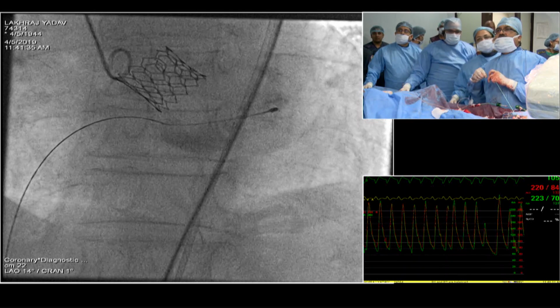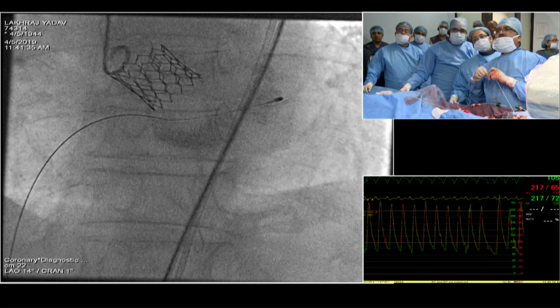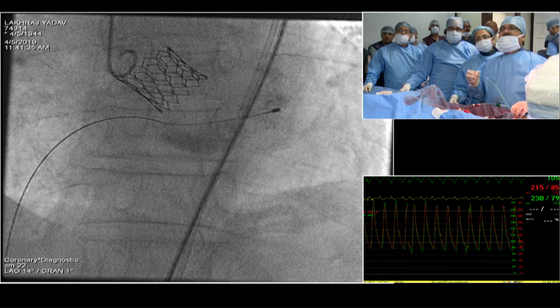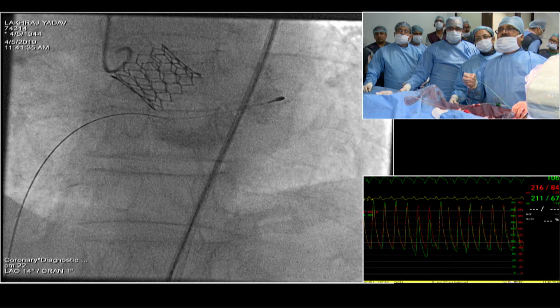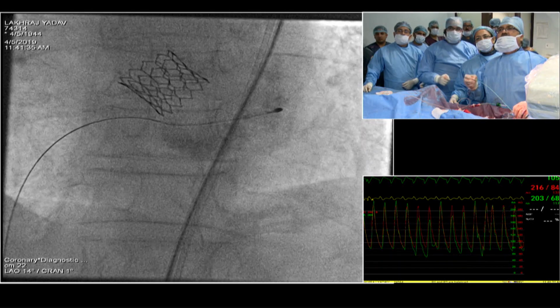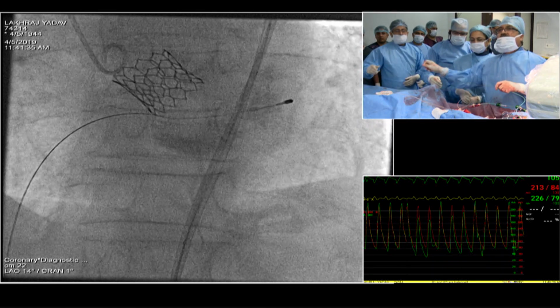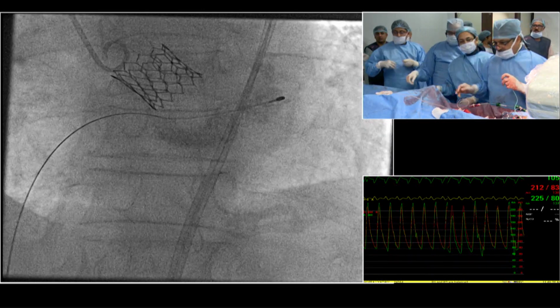Dr. Ramesh and others, actually, when the patients are so low, can you stabilize the patient a little with noradrenaline and then decide? Yeah, that is what we did, but the aortic regurgitation was severe. I think you could have taken some time to stabilize the patient then. Yeah, let us guide with the echo rather than doing angio at this stage.